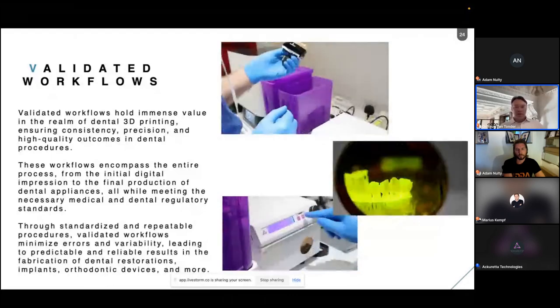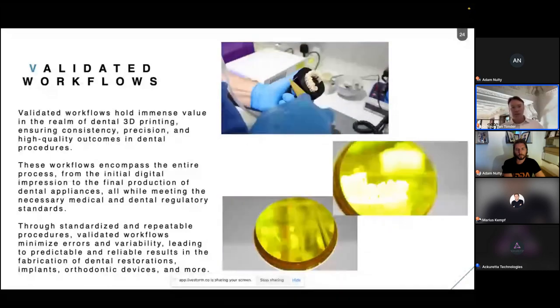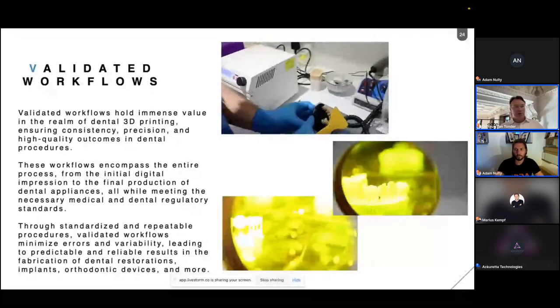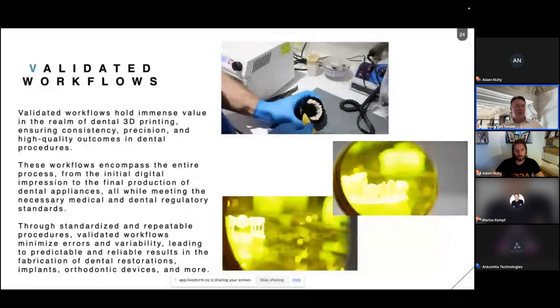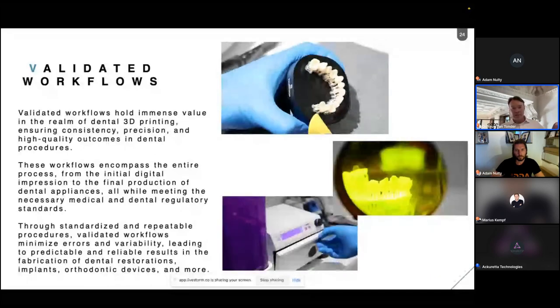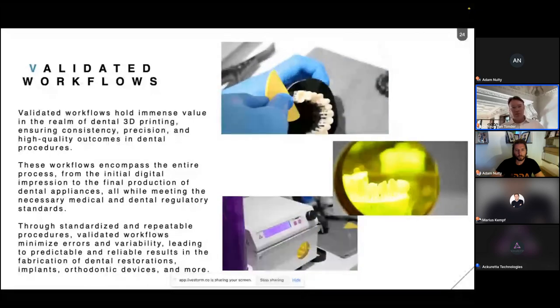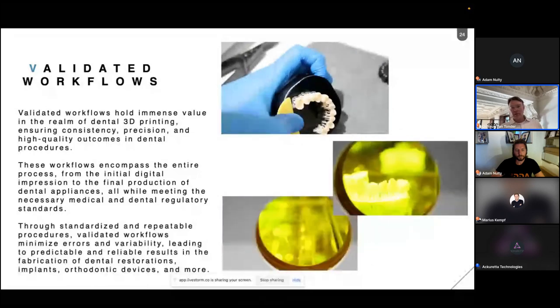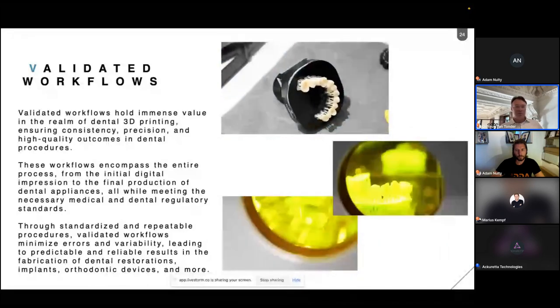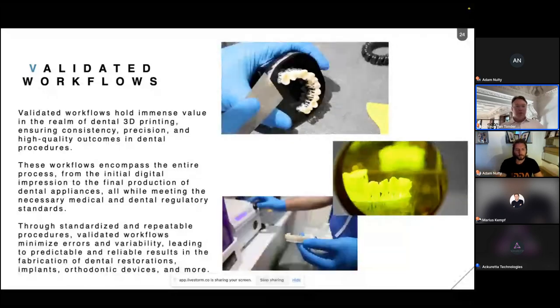When we started with 3D printing, the post-processing was something that you just had to get out of the way, to clean the resin off your print. It's become a lot more than that, especially because we are using monomers and resins. It is really, really important that it is cleaned properly, cured properly, and handled correctly. At the end, I assume we will get a few questions about this, and Marius will also talk about the BEGO specific resin, how to deal with that and finishing that. So Adam, you can go to the next slides.